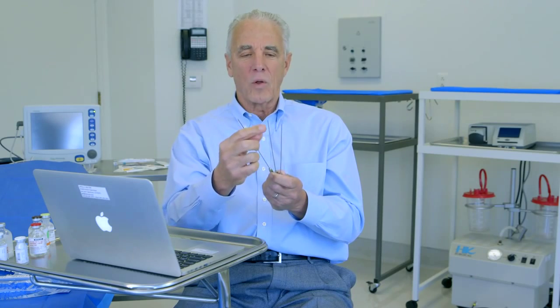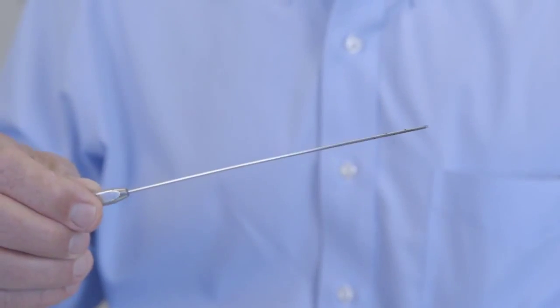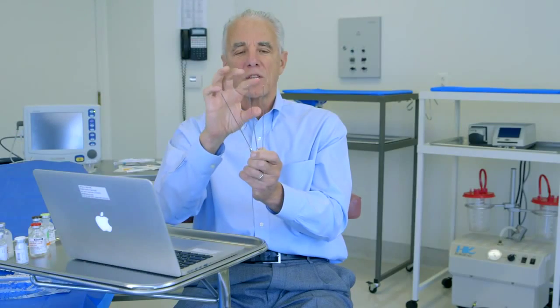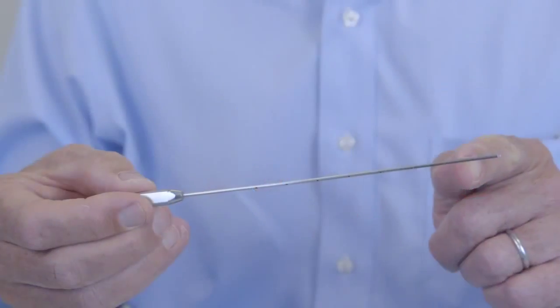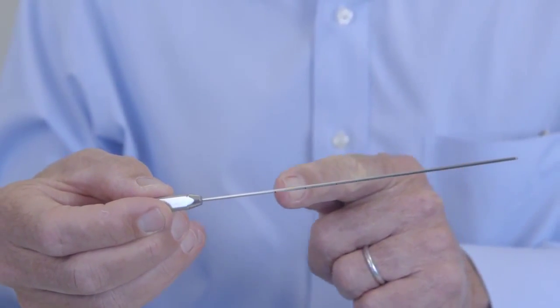And these have holes. For example, this is a cannula with holes that come down to this far on this blunt-tipped cannula. This one has holes that come down about halfway, and these come down all the way down to here. And these are used in a very specific fashion. This is the tip Monty, a half Monty, and the full Monty.